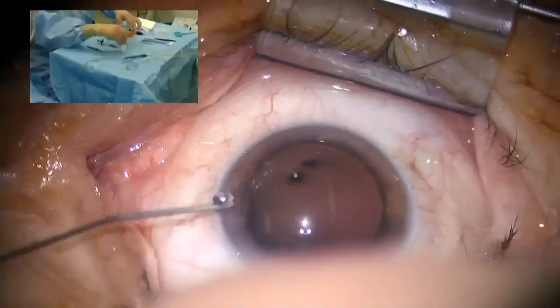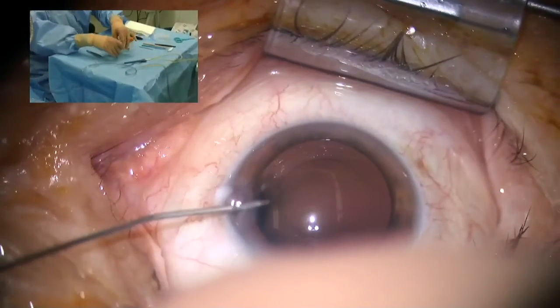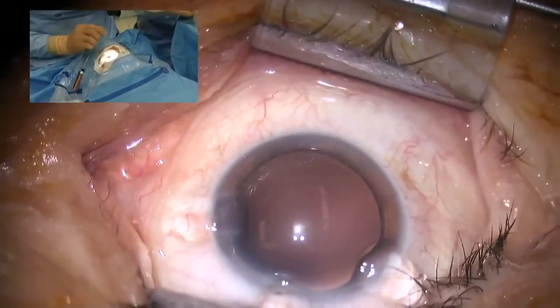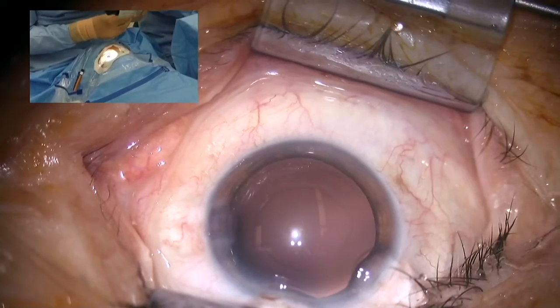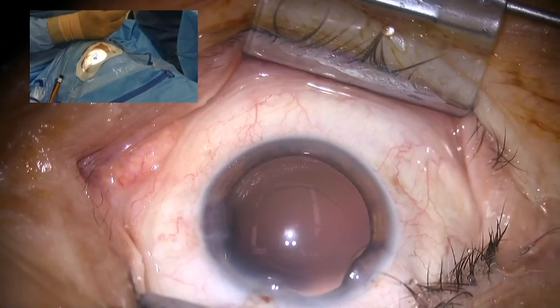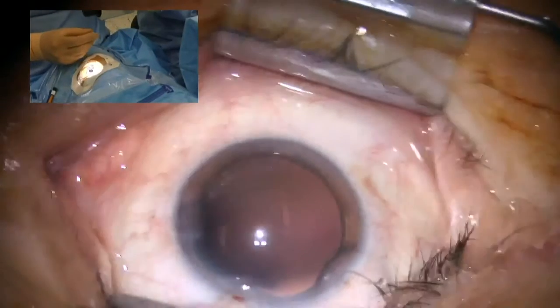So now we will do the implantation of the toric IOL. It's a hydrophobic IOL, a normal 3-piece design. This one is not preloaded because it's 26 diopters with a toric of 2 diopters.